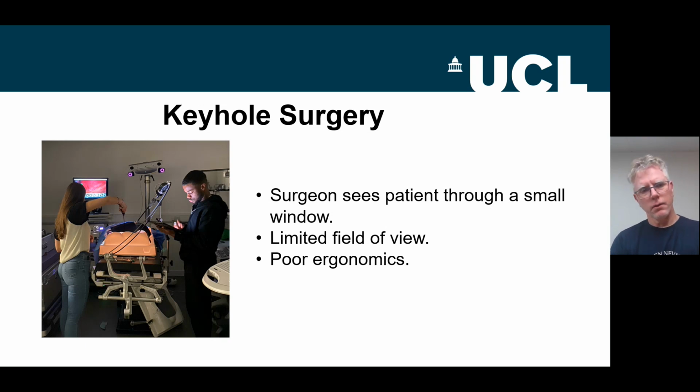We can see the person on the left of the image is trying to perform a procedure using a laparoscopic pivoted tool inside the plastic torso on the table in the middle of the picture. And to perform that procedure, they are looking at a screen in front of them with a camera feed from a laparoscope. You can see the laparoscope in the middle of the image. It's the thing with a cable hanging off it.